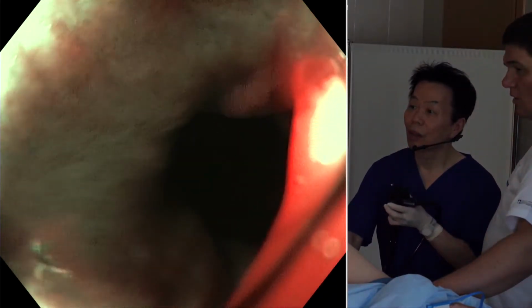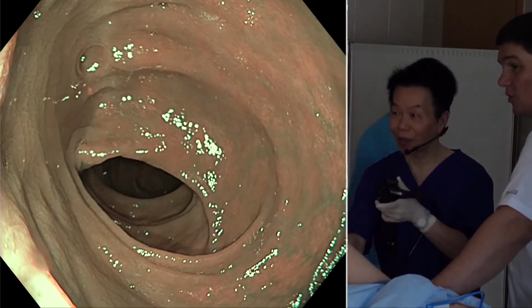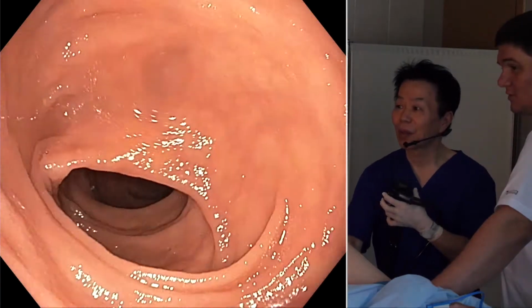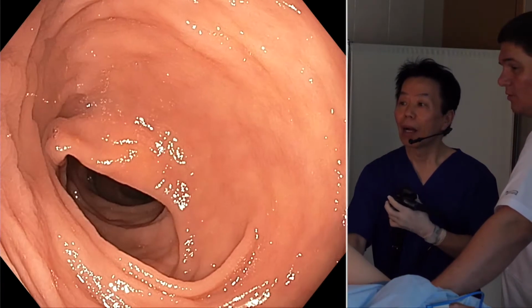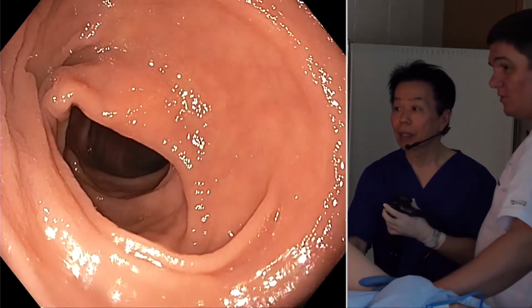Oh, so this will be the end of the procedure. Is it okay? Can I finish now? Yes, if you think that it's all, yes. In my practice, I usually use the retroflexion in the rectum.